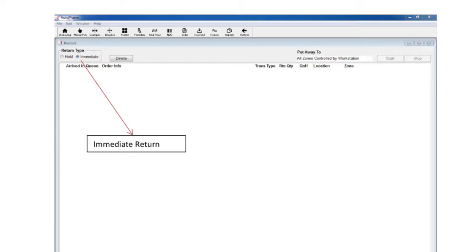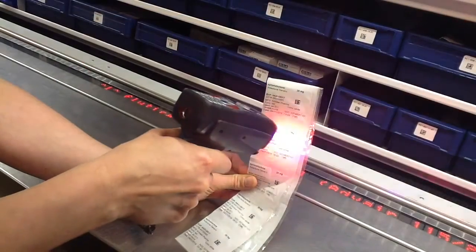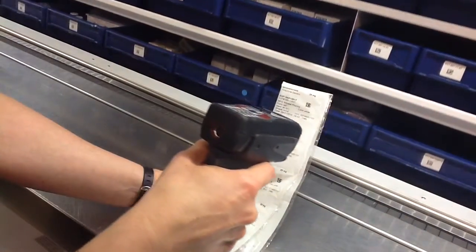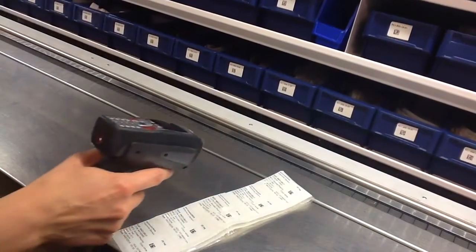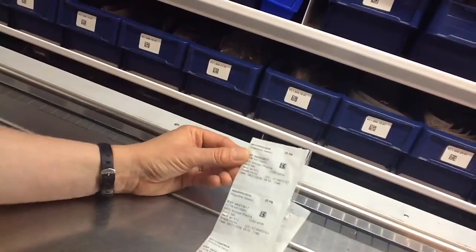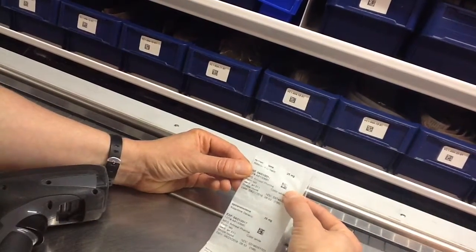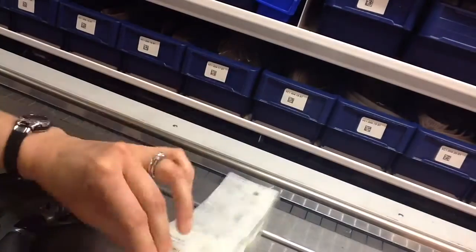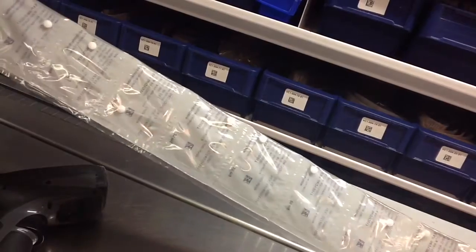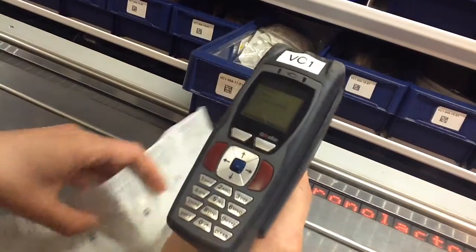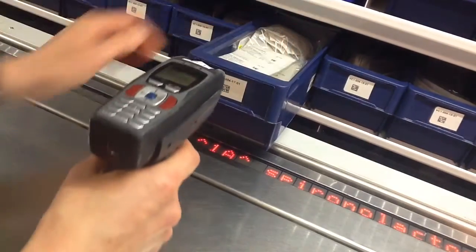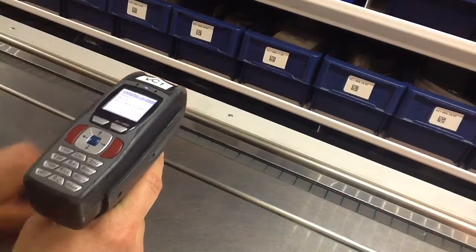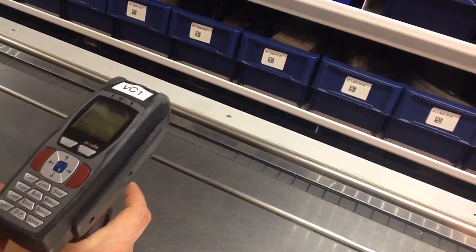Use the immediate return type to put away medications returned to the pharmacy. Start the immediate return by scanning the item. The carousel will spin to the location and the tick bar will light up. Before placing the medication in the bin, be sure to change the quantity to reflect how many are actually being refilled into the carousel. A quality control check is required when refilling multiple packets of unit dosed medications. Perform a visual check of the items to ensure the unit dosed medications are all the same. Finish the transaction by scanning the correct bin and placing the medication inside.